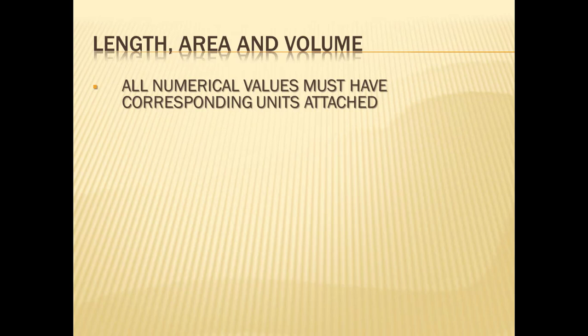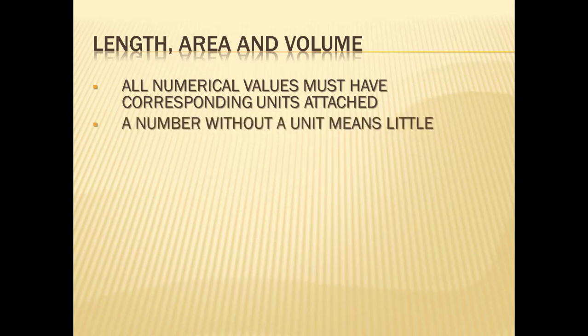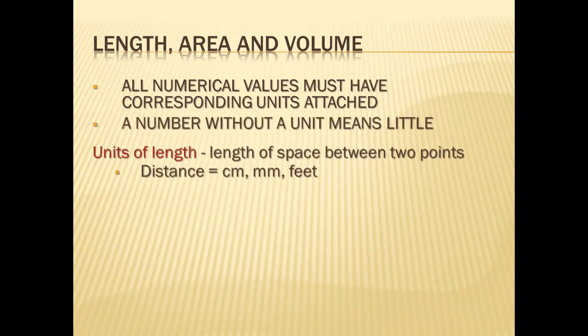Let's talk about length, area, and volume. All numerical values must have corresponding units attached. So for example, if I ask somebody how old she is, if they reply 3, that doesn't make sense. Why? Because they might be 3 years old or 3 decades old or 3 weeks old. So always remember, whenever you're memorizing the formulas, you should always have the units memorized as well, because in the boards they ask you questions about units. A number without a unit means little.